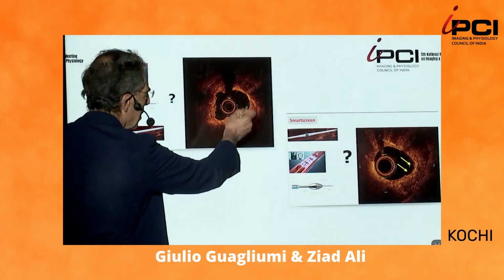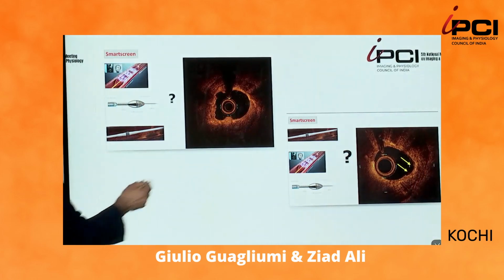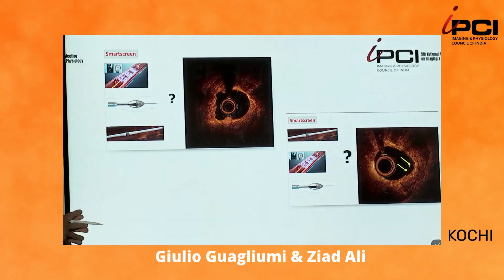And when we have done a rotational atherectomy and we have these types of images, what should be done in terms of measurements? Is it enough because we used a 1.5 burr and we ended up with this, or do we need to go more, upsizing the burr or treating with some additional aggressive lesion preparation?